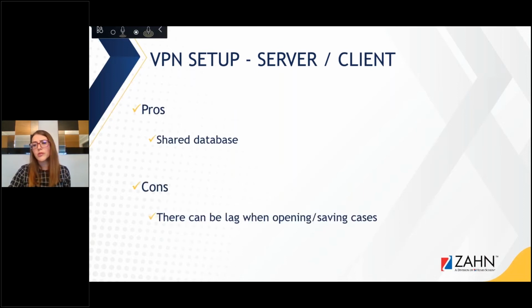So of course, the pro of this kind of setup is that it has a shared database, so you don't need to be transferring the files back and forth. The files will be immediately available to the remote office or the remote user as soon as they're scanned in the main office, basically. The con is there can be lag when opening and saving cases because everything is accessed remotely.